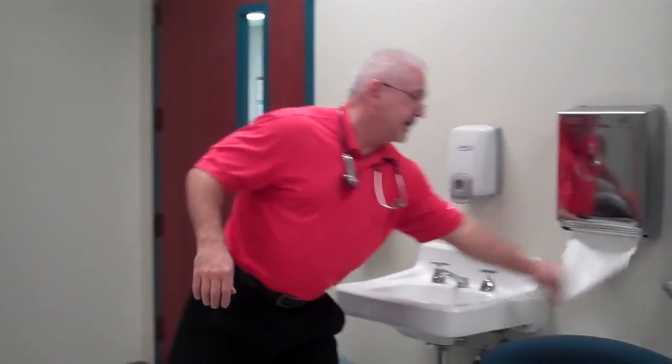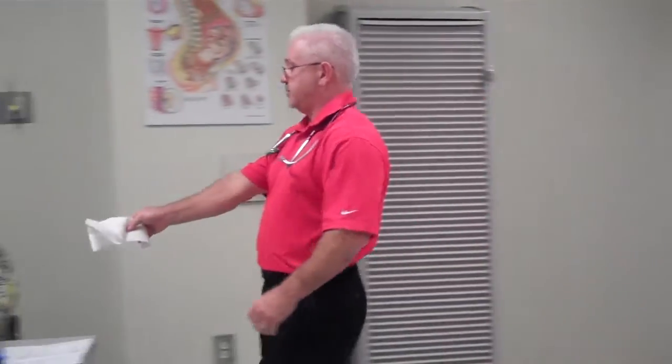At this point, I will ask the patient, how do you feel? I feel better. Okay, very good. I need you to do me a favor. I need you to take a deep breath in, and here is a paper towel, and I want you to cough hard into the paper like this. It's kind of a huff cough. Okay, very good. Did you cough up anything?